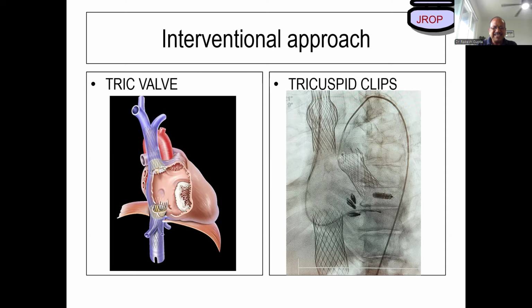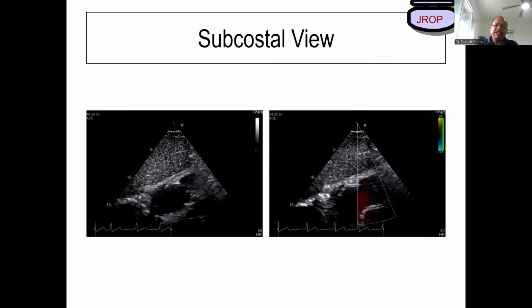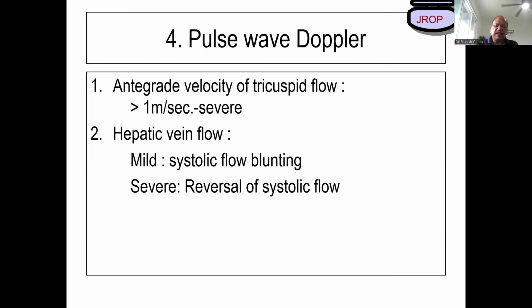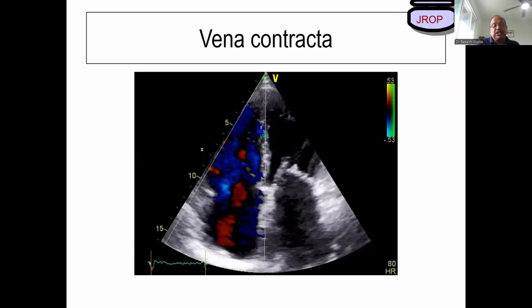My question is, sir, about the measurement of vena contracta in mid systole. How is it different from the measurement of cusp separation? Cusp separation is a two-dimension finding. Ideally, vena contracta and cusp separation should be the same. Is there any difference technically? The difference is there. They may not be the same as cusp separation.